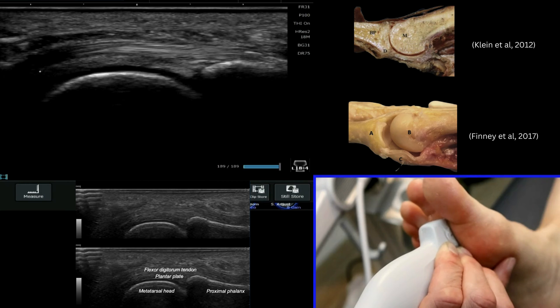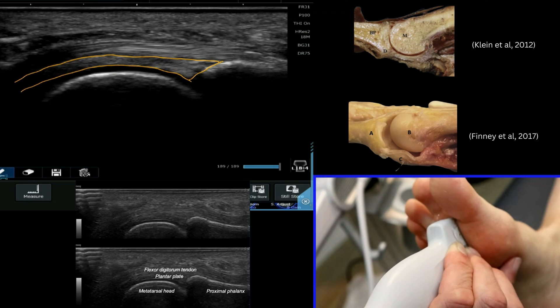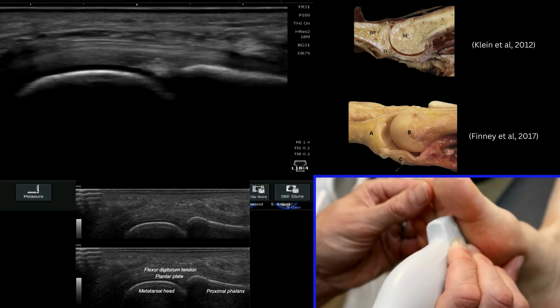If I draw that on for you, you can see it's very similar to the volar plate that we see underneath finger joints, and you can see it has this wedge shaped insertion. This area here is where we'll often see the most artefacts, and that's where we've got to be very careful of our probe angulation.